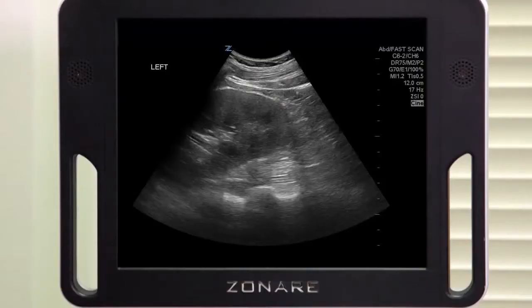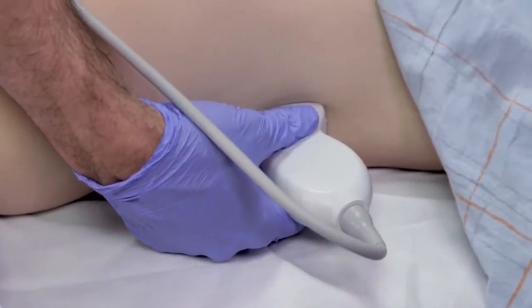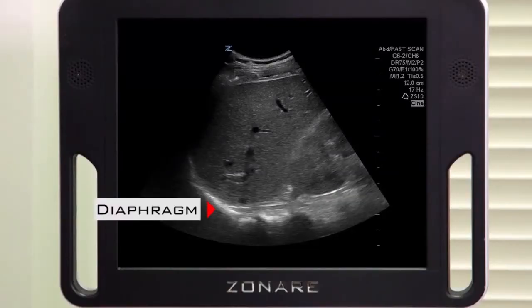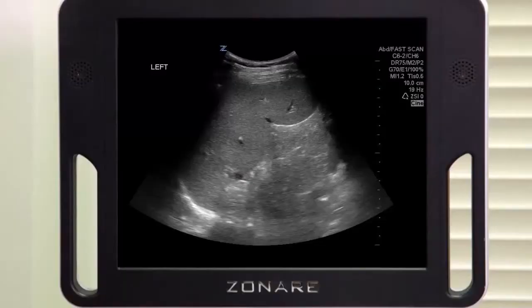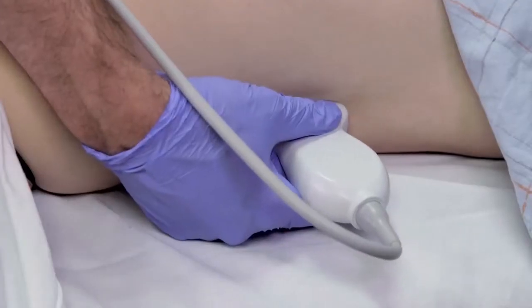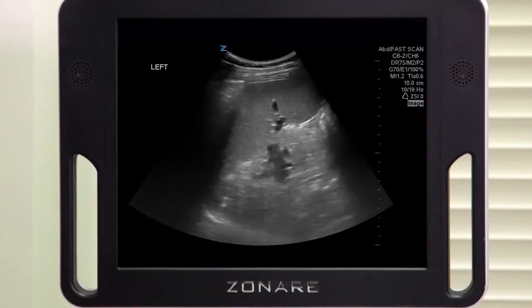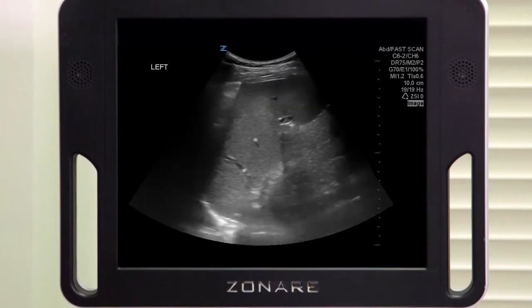We've evaluated the splenorenal recess. Come down to the paracolic gutter — same technique: psoas muscle, inferior pole of the kidney, up to the ceiling, down to the bed. Come back; the kidney is your guide. Then slide up towards the patient's head to the hyperechoic diaphragm and look above it for any hemothorax or pleural fluid. It's particularly important on the left side that you see every single edge of the spleen and the tips of the spleen, because fluid often accumulates along the splenic edges without collecting down into the splenorenal recess. Ultrasound isn't great for solid organ injury, but as technology improves we are picking up significant solid organ injuries, particularly higher grade ones, so get in the habit of evaluating your solid organs.